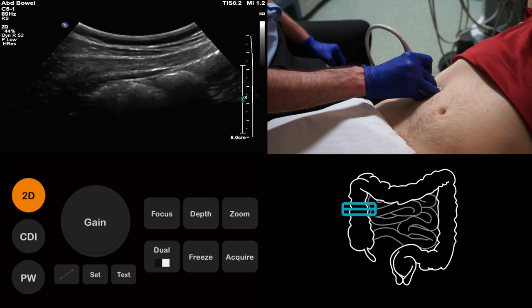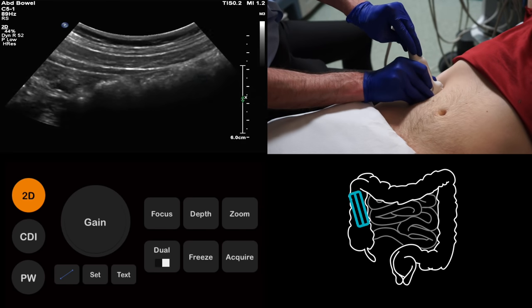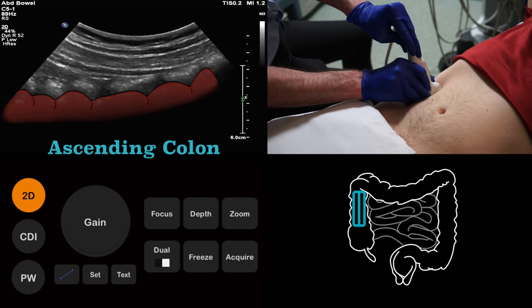As the bowel is likely to contain gas, the ascending colon will appear as a densely echogenic structure. But how do we tell the large bowel from the small bowel? Well, the colon will have haustra, which gives it a lobulated contour, while the small bowel has valvulae conniventes, which do not cause undulations in the bowel wall. By turning the probe into the long axis of the colon, we are better able to see the haustra, and therefore confirm that we are looking at the large bowel.